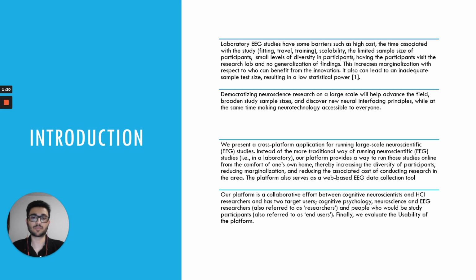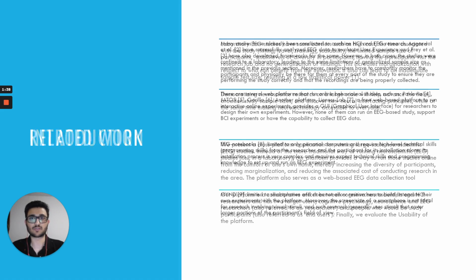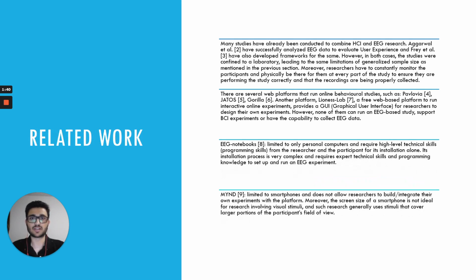The platform is a collaborative effort between cognitive neuroscientists and HCI researchers and has two target audiences: the researchers, who could be from a cognitive neuroscience background, psychology, or EEG background, and people who would be study participants, also known as end users. We also evaluate the usability of the platform. This is the list of related work associated with our research.